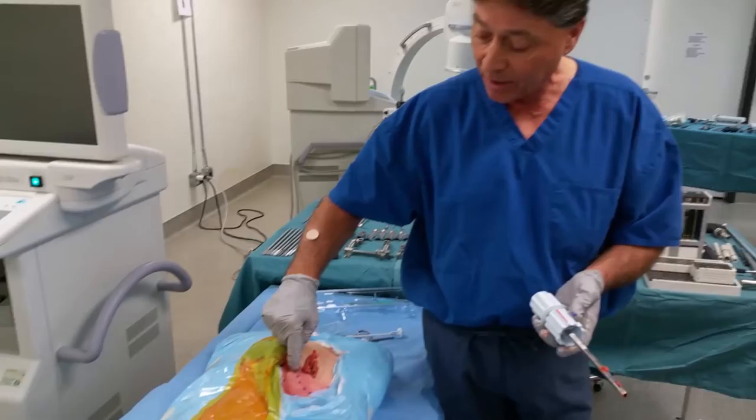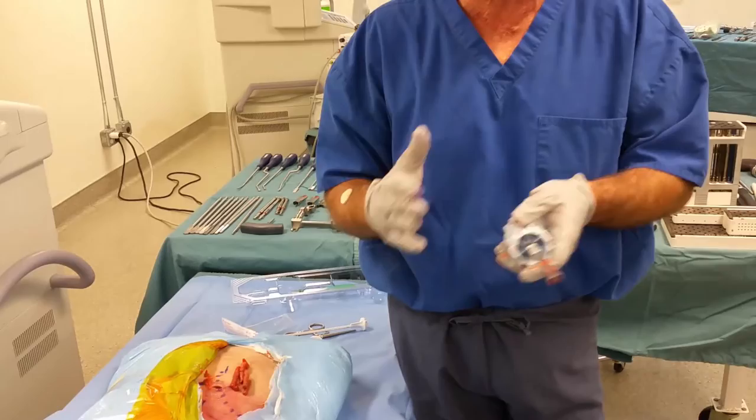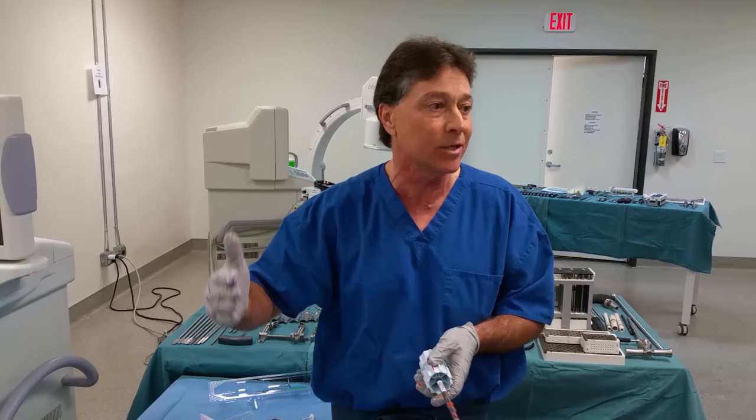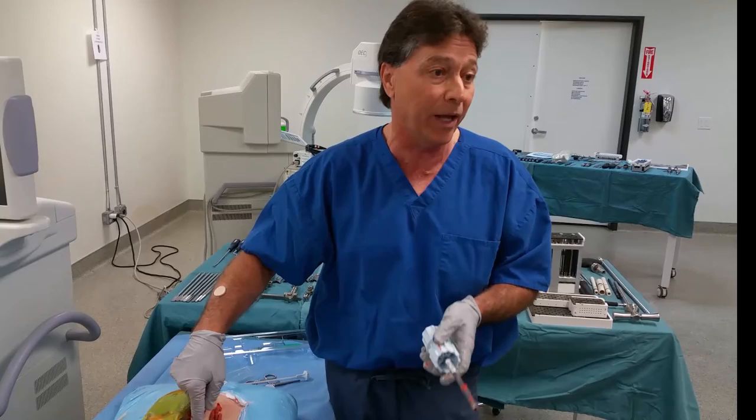This type of minimally invasive approach — there's no soft tissue stripping. That's one of the reasons why people had pain in the past. And we're not removing the cortical walls medially or laterally, so you don't have any destabilization. Remember in the older procedures, that whole ilium — the attachment of your gluteus medius, gluteus minimus, and gluteus maximus are all along the ilium. Imagine what it's like when you strip the attachment of your locomotor muscles — of course you're going to have a lot of pain, and it can be chronic. But this boils down to trivial or negligible pain, sometimes no pain.